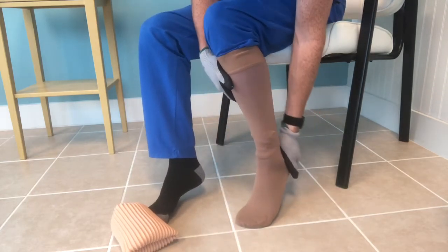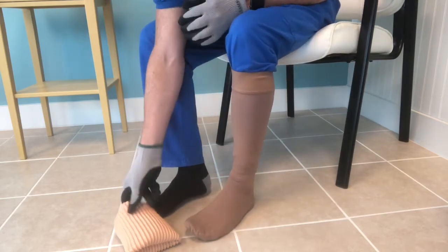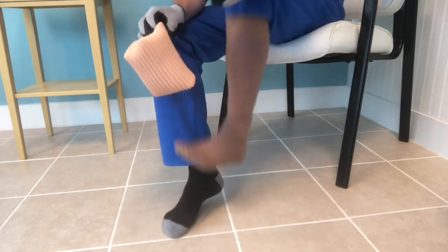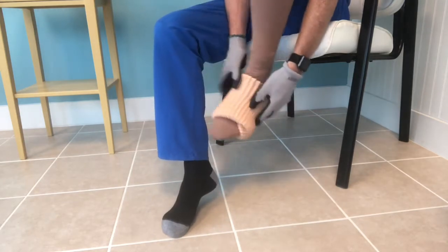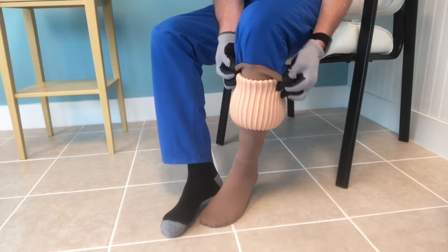Of course you would never put it on top of the pants the way I'm doing it here — this is just to show how it works. Now I'm going to show how to use it in reverse to take the compression sock off.